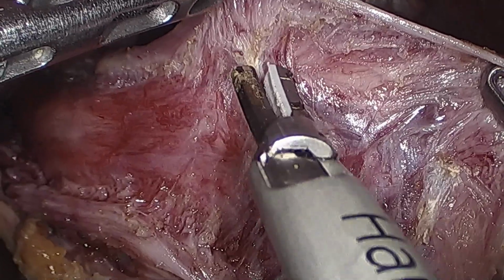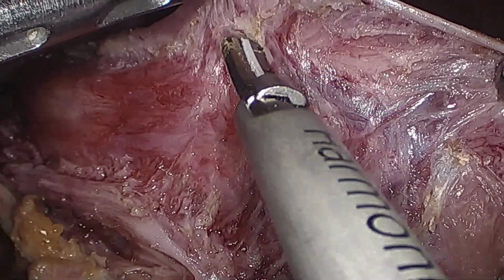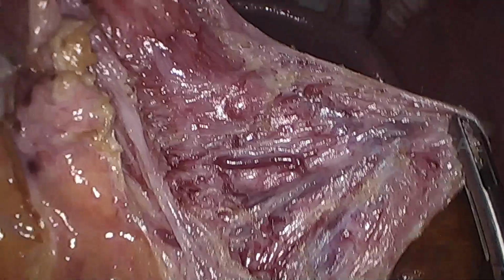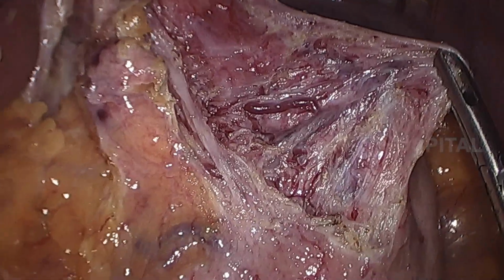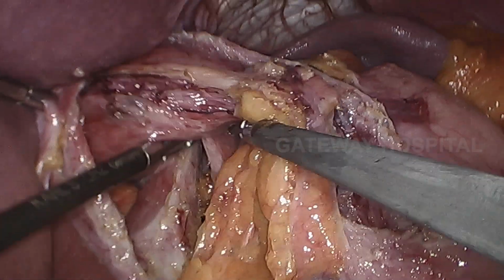So that is close to the esophagogastric junction, and we have done a nice gastric side myotomy also. You can appreciate the completed myotomy. It has gone into the dilated segment, and also it has gone into the stomach for at least 2 centimeters.